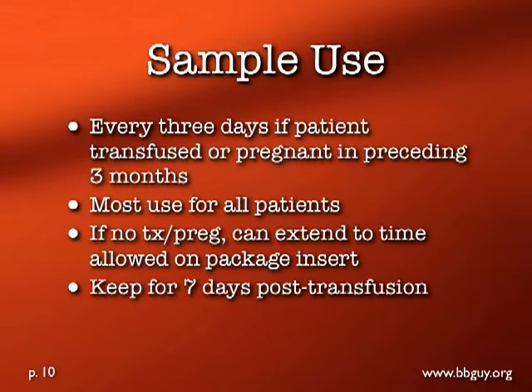You also need to keep the sample for at least 7 days post-transfusion. So what that fundamentally means, because you have 3 days on the front and 7 days on the end, most transfusion services will keep samples for at least 10 days from the time that it arrives.